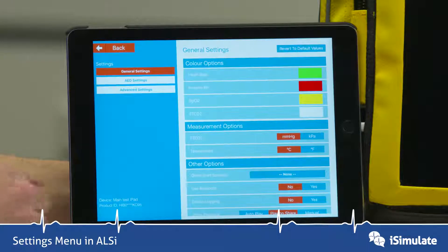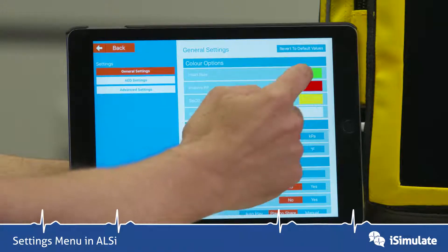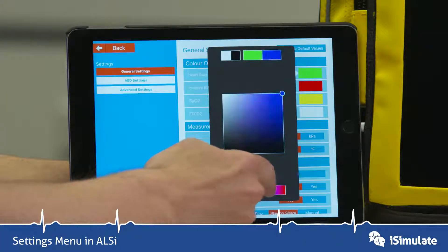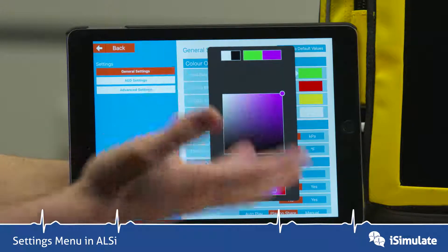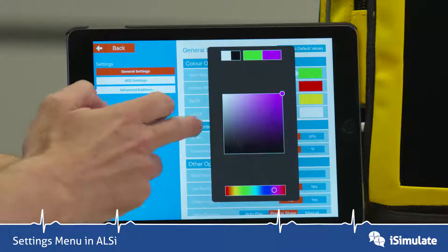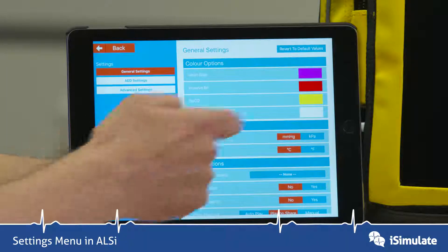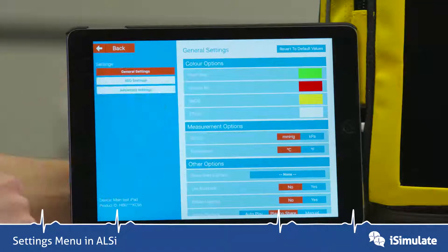If you look at General Settings, the main things you can change are the colours of the actual waveforms that are seen. By just tapping on one of these boxes here, you can change the colour you want to display the waveform in, depending on your local use. You can see it's changed there, and if you press Revert to Default Values, it goes back to the original green.